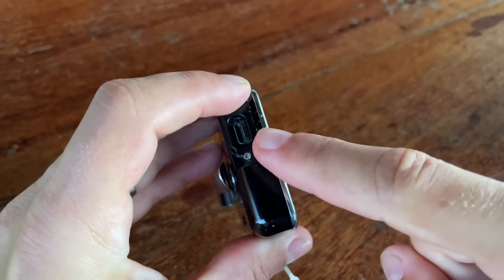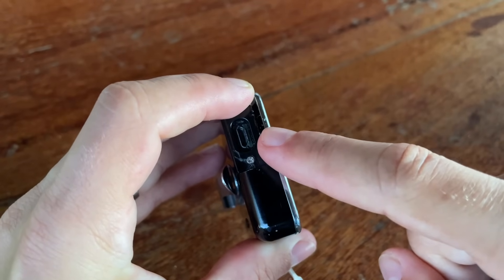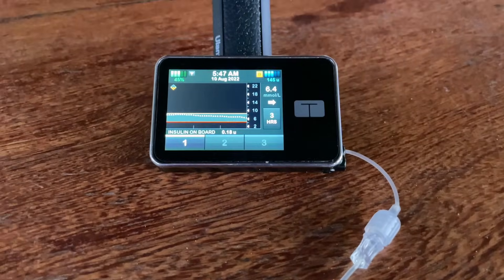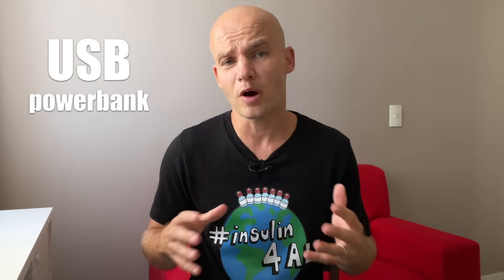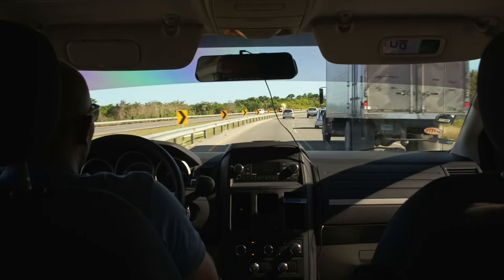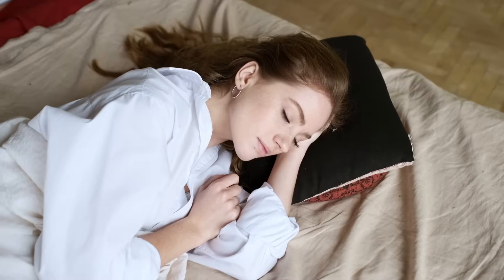There are a few disadvantages of an integrated rechargeable battery. First, it takes about an hour to fully charge and during that time you need to be hooked up with a cord. A USB power bank is definitely an elegant solution here. Some people charge it at work at their desk, or in a car when they commute.